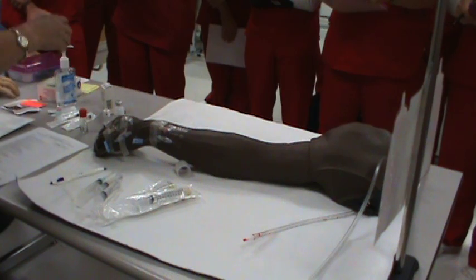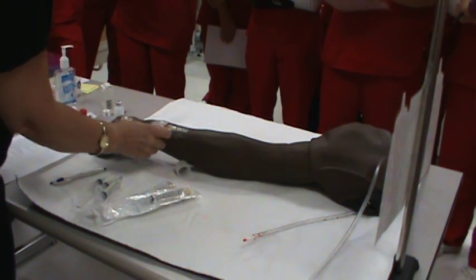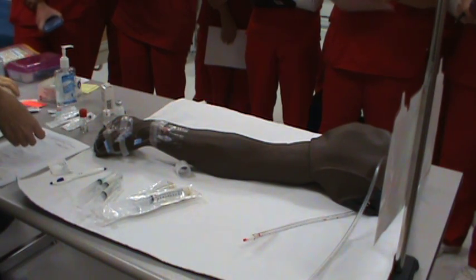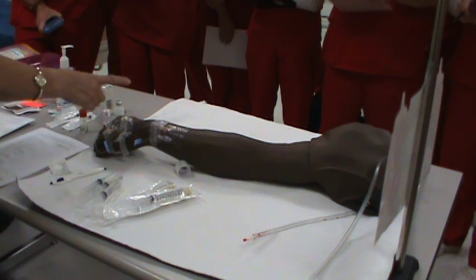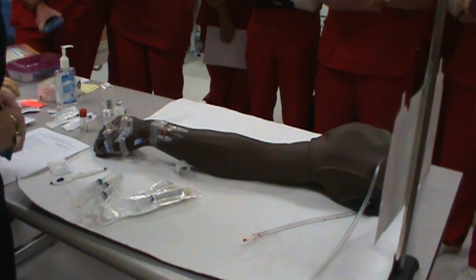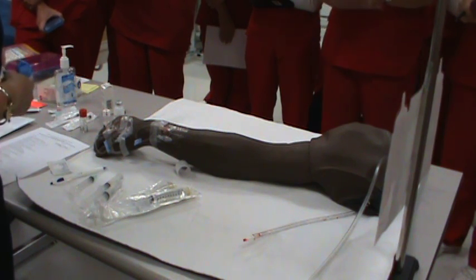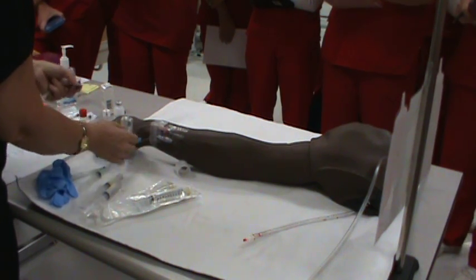Take your alcohol, scrub your hub for how long? 30 seconds. Right. You can do clean gloves. Yes, get clean gloves. So get your clean gloves, scrub your hub. Check patency, how do you do that? Flush. Are you going to try to aspirate? Yes. What if there's no blood back? Doesn't necessarily mean anything. Right, flush it. So we use this one.